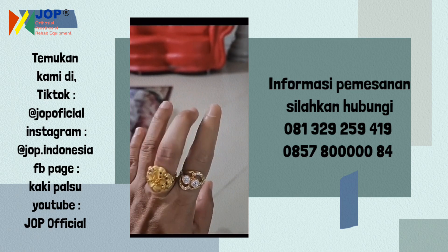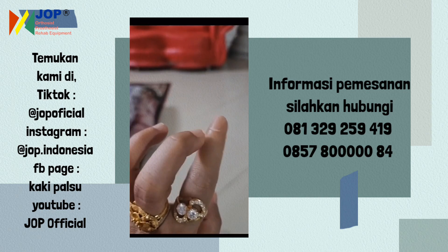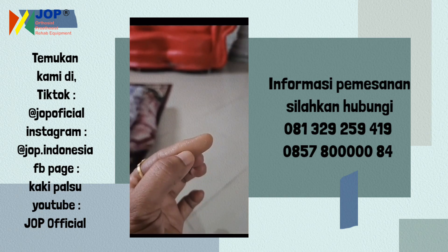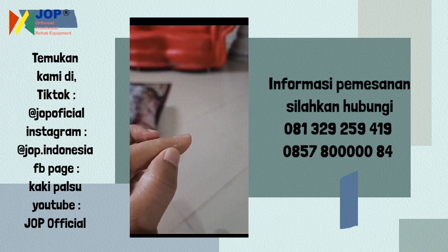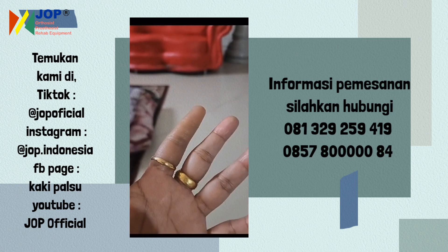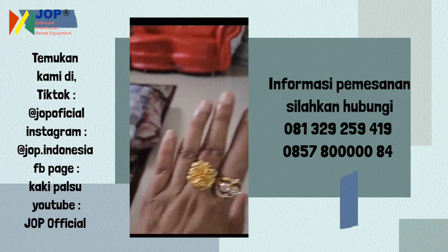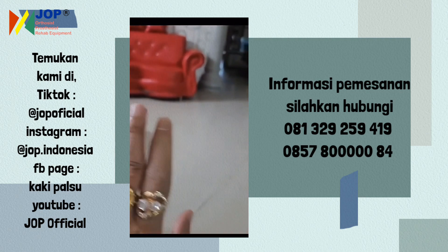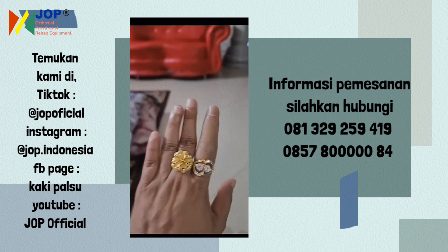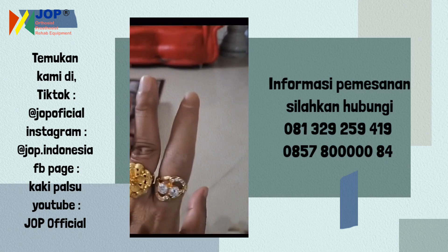Lubangnya sampai sini, tapi dagingnya sampai sini — dagingnya sampai sini biar enak. Besarnya sama kayak gini, ukurannya sama ya. Cantik, pesan lagi ya, buat ganti-ganti — kadang takutnya ini rusak.